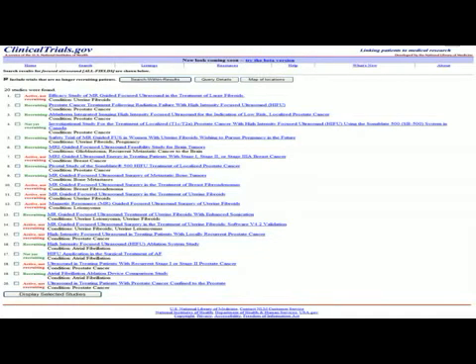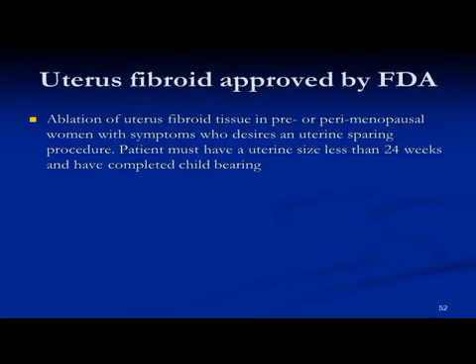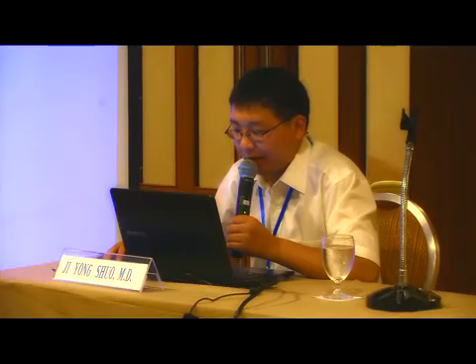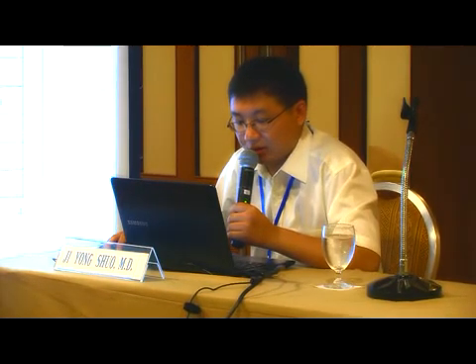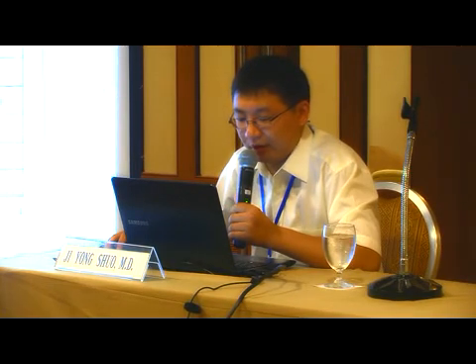The treatment of HIFU under the guidance of MRI is the most advanced at present. It can not only orient the direction but also precisely measure the practical temperature of the target area. The result is the same as before, with relieved symptoms and reduced tumors. Many clinical experiments prove the same result, such as this uterine fibroid approved by the FDA, and this. There are many experiments. This is the result of the follow-up.